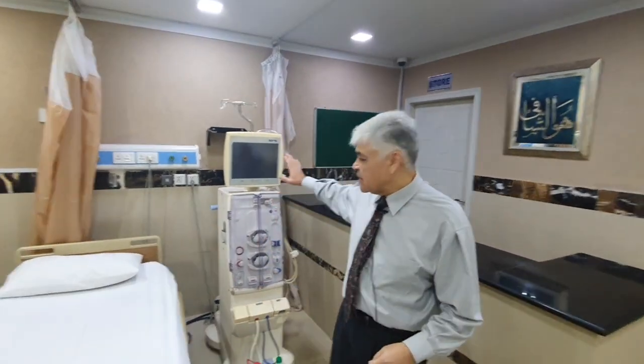I'm going to be showing you a hemodialysis machine, how it works, the various disposables which are used in the running of a dialysis machine, and then in further videos, we'll see how the dialysis machine is set up, how it is primed, and then further on, we'll actually take you live to the patients. We'll see how the various vascular access are accessed, and what are the complications which you can see during a dialysis procedure. So what I've got here is a hemodialysis machine.